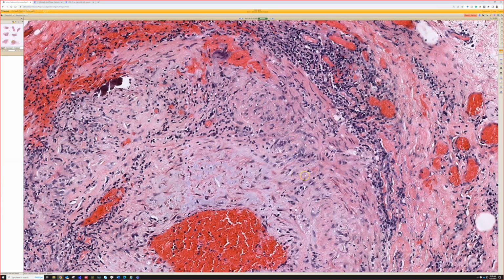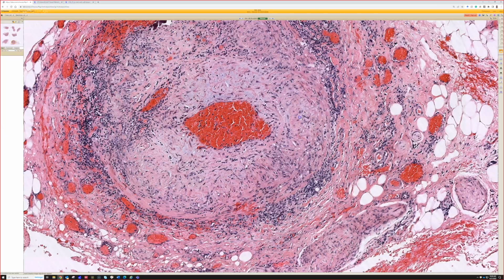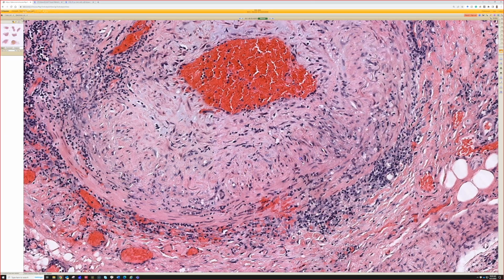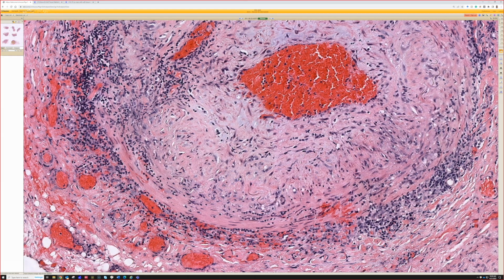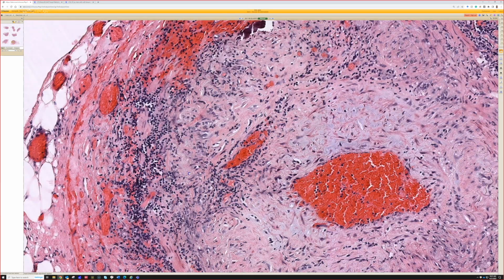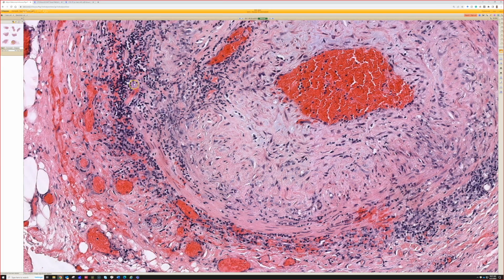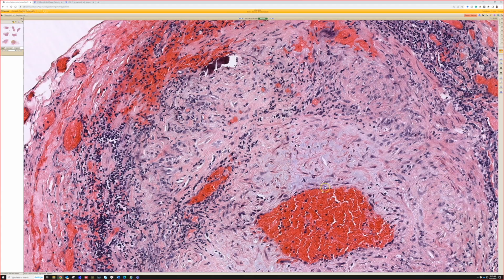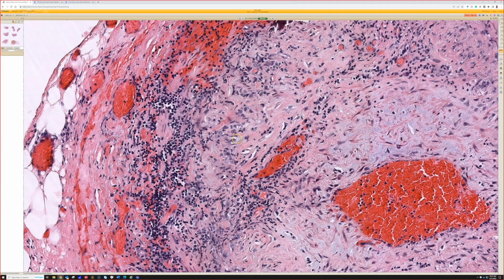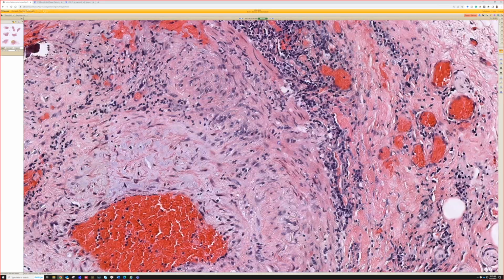Yes, very good. In the muscular artery here, the temporal artery, we can see there's a little bit of elastic lamina. It's much easier to see on a regular light microscope where you can flip the condenser back and forth to see the refractile lamina, but the lamina is being destroyed by this inflammatory infiltrate that's destroying the muscular wall, and the intima has a ton of reactive change. There are a lot of lymphocytes and histiocytes, and if we hunt around, we will probably find some giant cells.